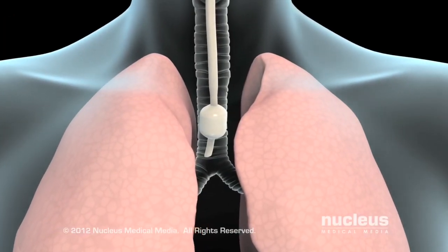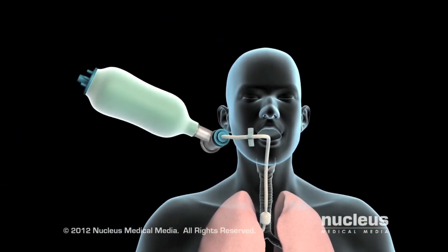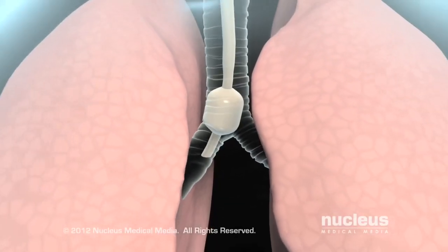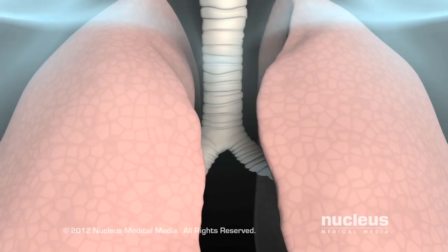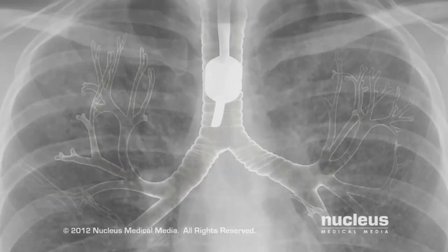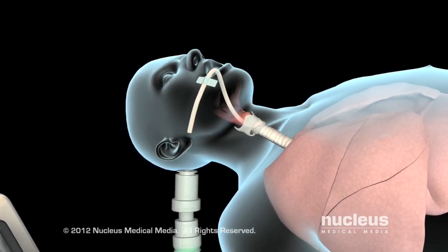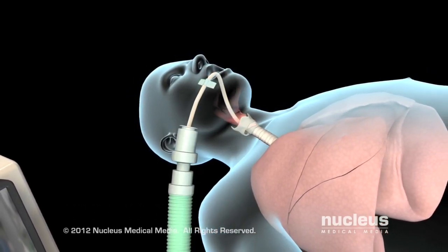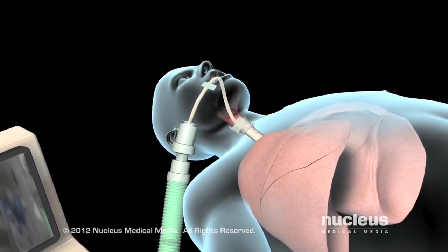Your doctor will check to see that the tube is properly positioned in the lower part of the trachea by inflating your lungs with a special bag and listening for breath sounds on both sides of your chest. If the end of the tube is too low, both lungs will not receive the same amount of air. In some cases, an X-ray is taken immediately after intubation to confirm the tube's placement. Once the endotracheal tube is in the proper position, your doctor will attach it to the mechanical ventilator, a specially designed pump that aids respiration by delivering well-oxygenated air into the lungs and permitting carbon dioxide to escape from the lungs.